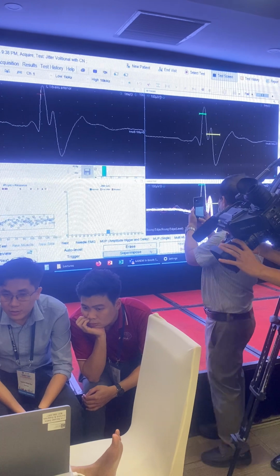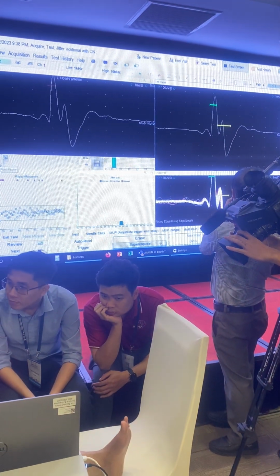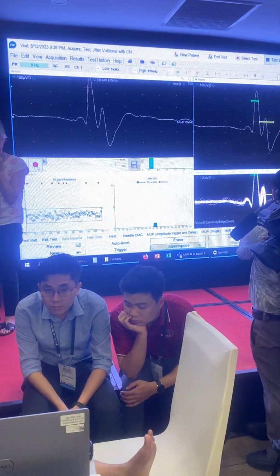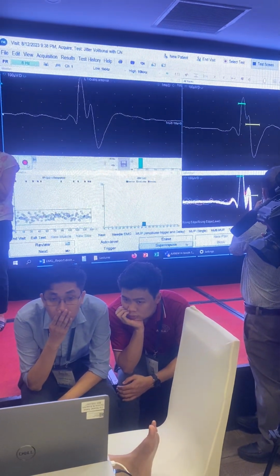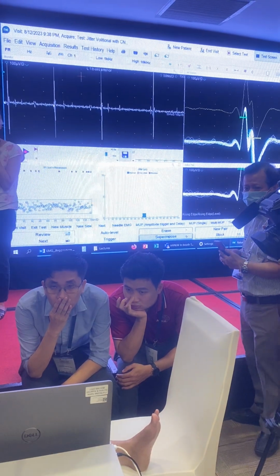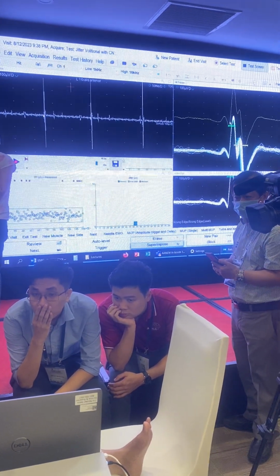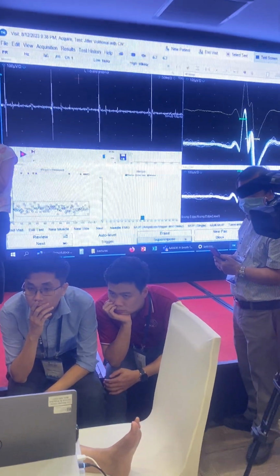Okay? So I'm going to stop recording over here, or maybe now I record for 100 or 150 discharges. Okay, so this is where my interpotential interval is very short. So instead of level, you may want to use peak for analysis.